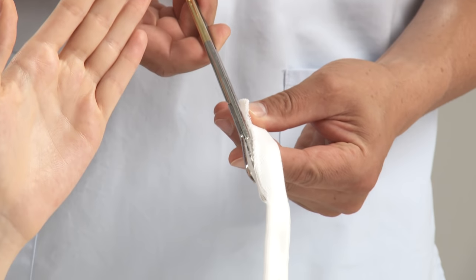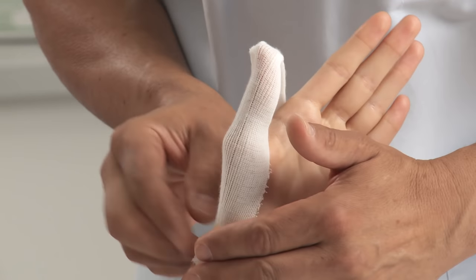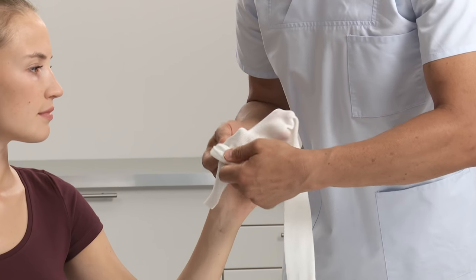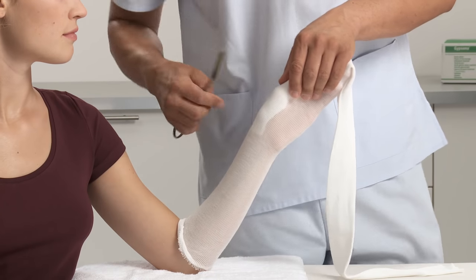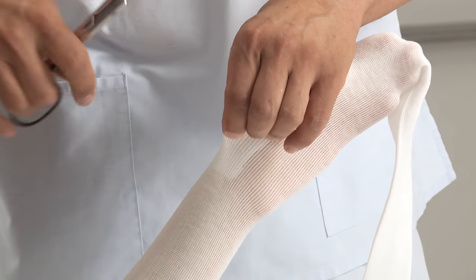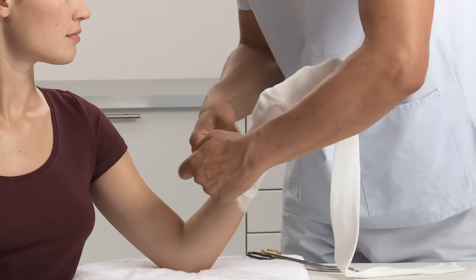Pick up the thumb stockinette, make a cut into the piece and slide it over the thumb. Roll up the arm stockinette before applying onto the limb to prevent sliding pressure during application. Roll off over the arm. At wrist height, make a cut into the piece, then insert the thumb through the hole and roll back down.